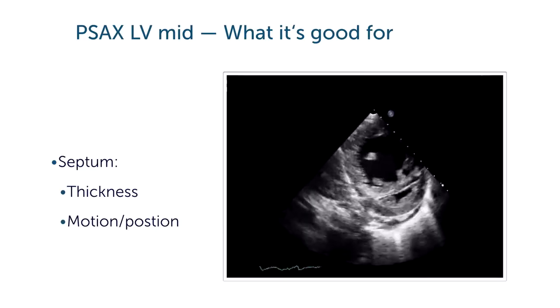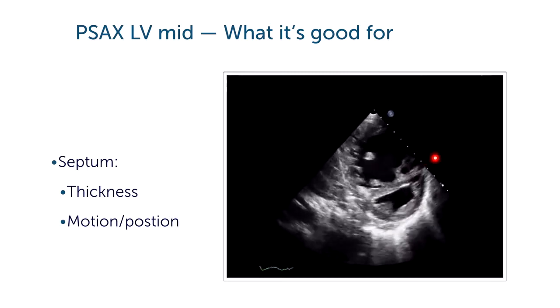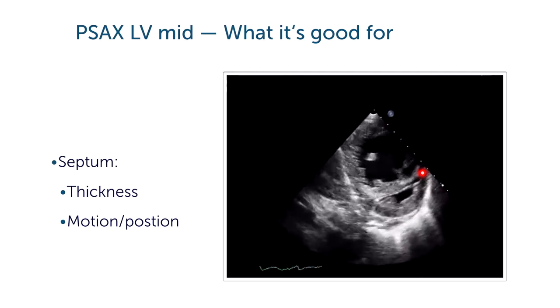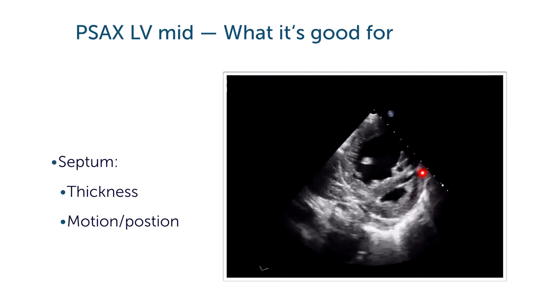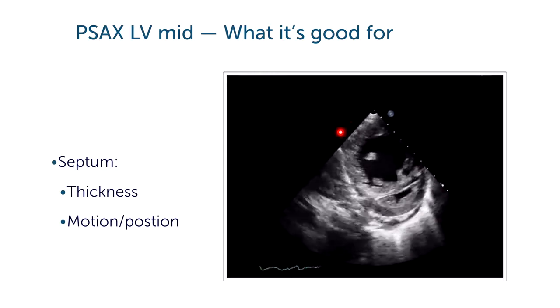I guess all of you realize that this is not a normal echo. Here you have septal flattening in a patient who has severe pulmonary hypertension. In addition, you can assess the thickness of the myocardium, especially of the septum, but also of the right ventricle.